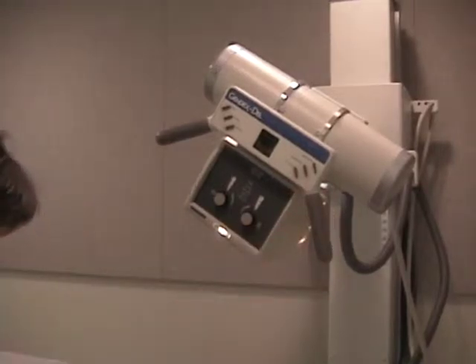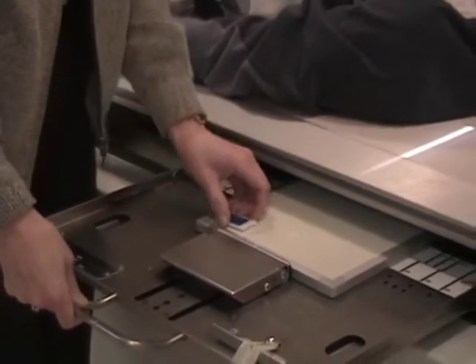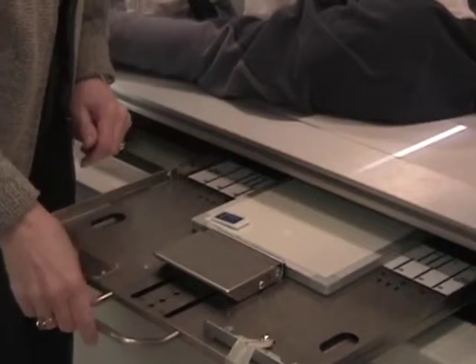And the TMJ is right here, just in front of the EAM. So I'm going to want to exit through that point. And we're going to exit to the center of the film. I've placed it 8 by 10 crosswise in the Bucky tray. And I'm using a left marker on the patient's left side.